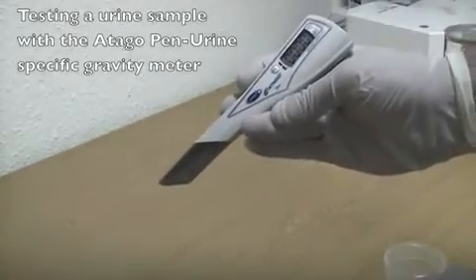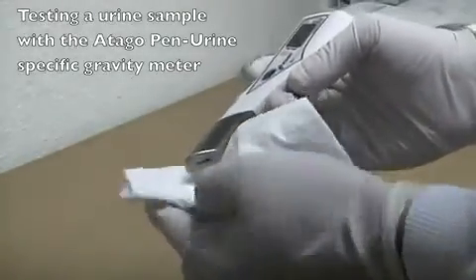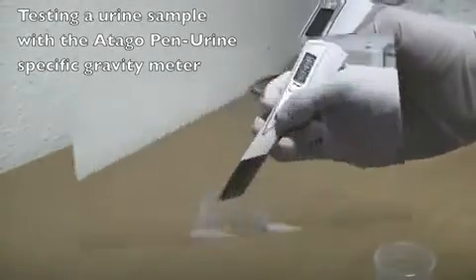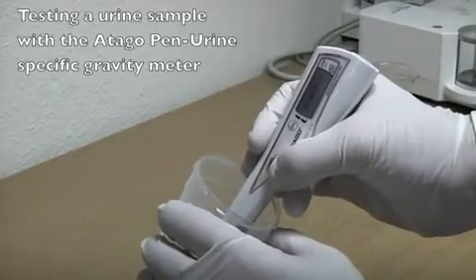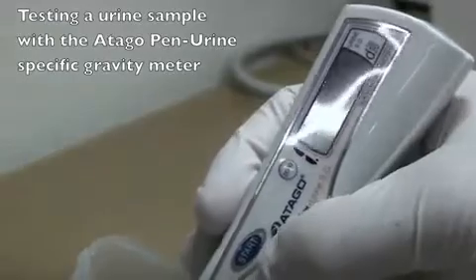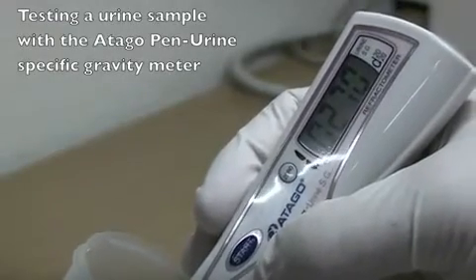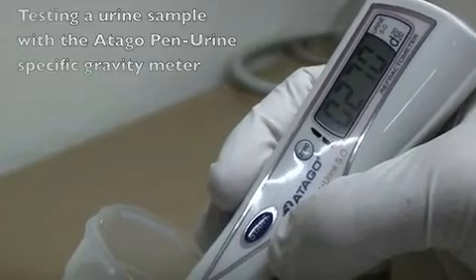The tip may now be dried. The probe is then put into the urine sample. Pressing start activates the reading and the value is shown within 2 seconds.